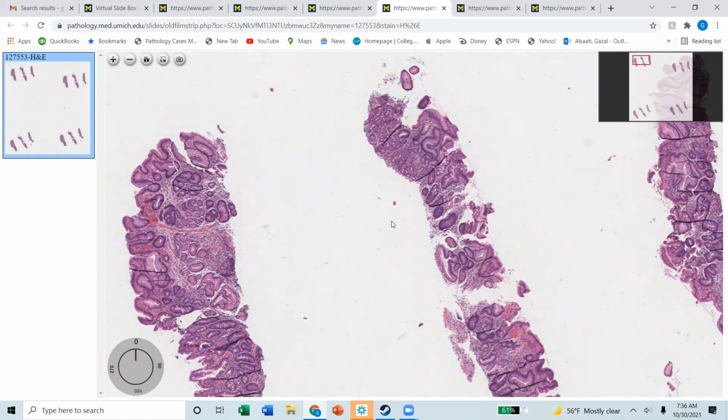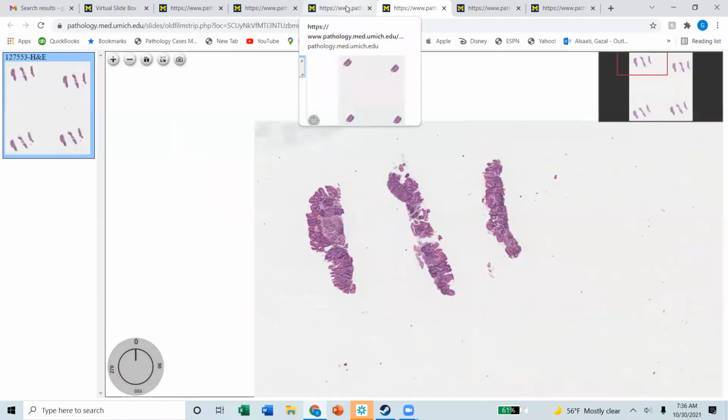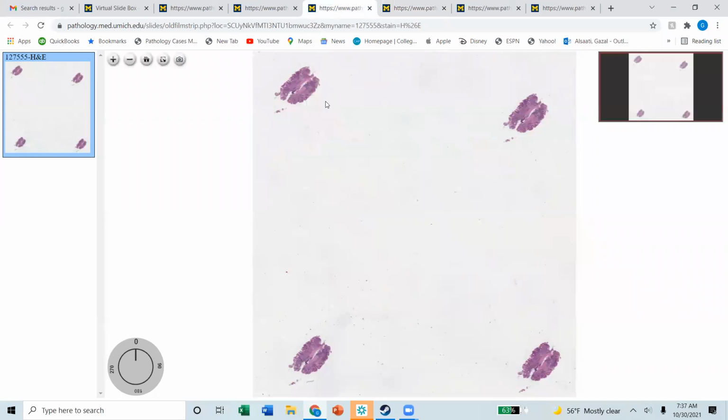And in every case you have to do an H. pylori stain, okay? Because H. pylori can look exactly the same, and it is more common, okay? I hope this answers the AMAG questions. I know, trust me, I did it through my fellowship, but once I was hit with the number of AMAGs during my work, I dug so deep to be able to be very systematic and make the diagnosis. It wasn't very spontaneous to me either.